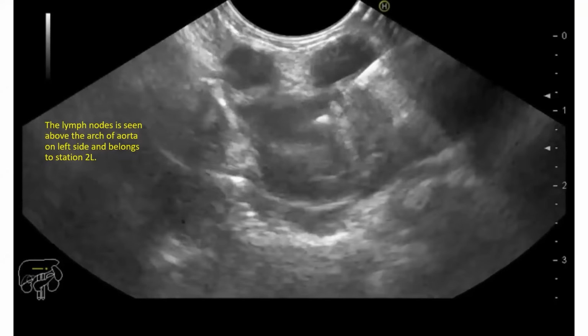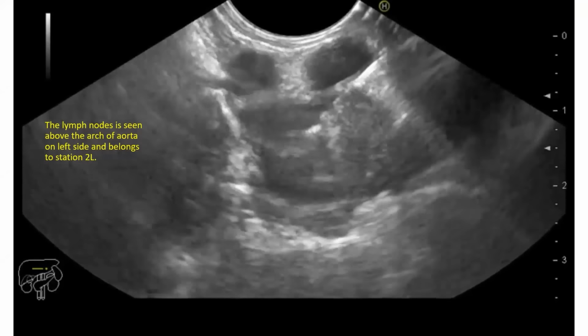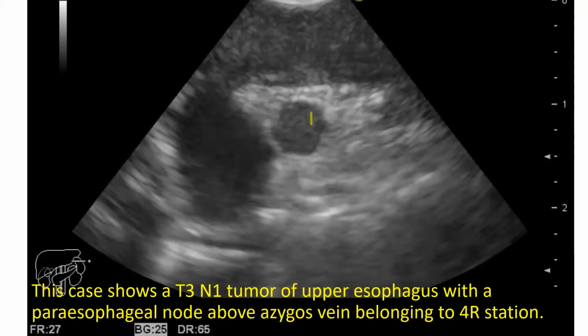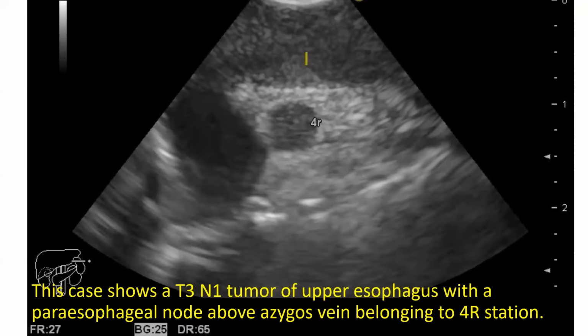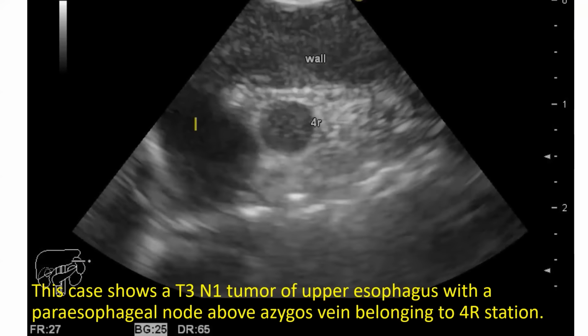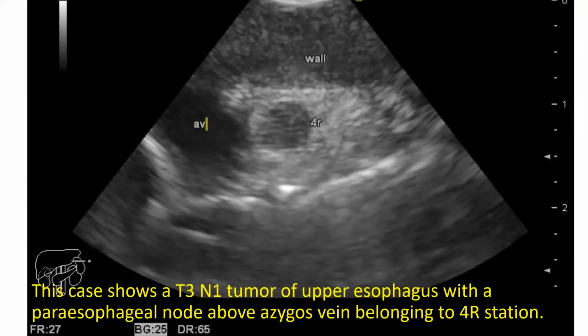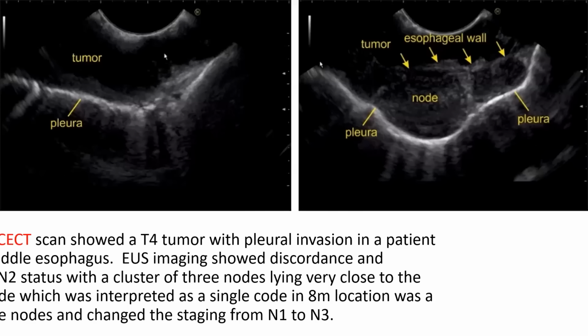The node in this image is seen above the arch of aorta and belongs to 2L, and we were not sure whether this is a malignant node, and FNAC was done. This is a lymph node which is just outside the upper esophagus, and this belongs to the 4R station. This is a wall tumor, this is a 4R node, and below is the azygos vein. So a thin caliber EBUS scope was used to assess this. This particular lymph node was missed by a CT scan.